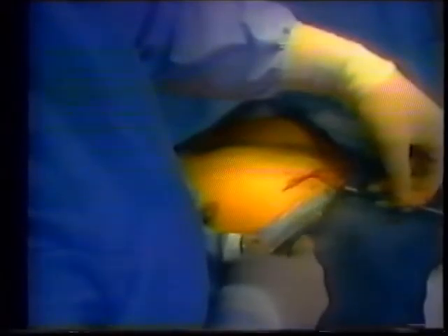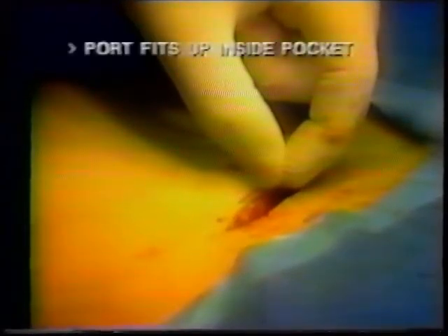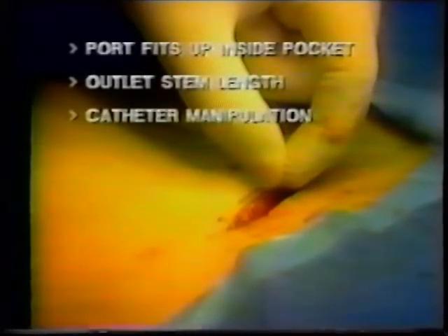Cut the catheter from the trocar at a right angle. After measuring the needed catheter length, cut it. When measuring, remember that the port fits up inside the pocket. The outlet stem length, along with any anticipated catheter manipulation, must be taken into account.